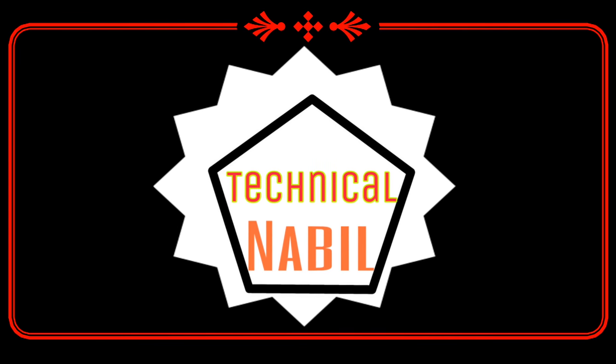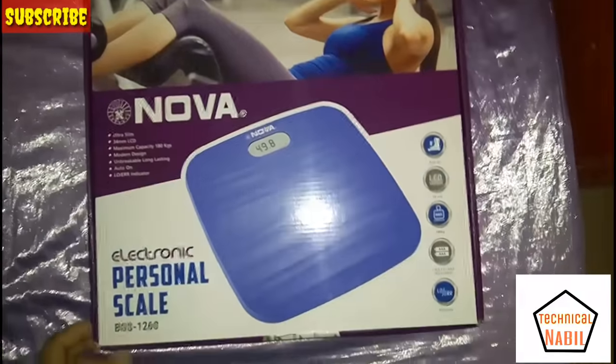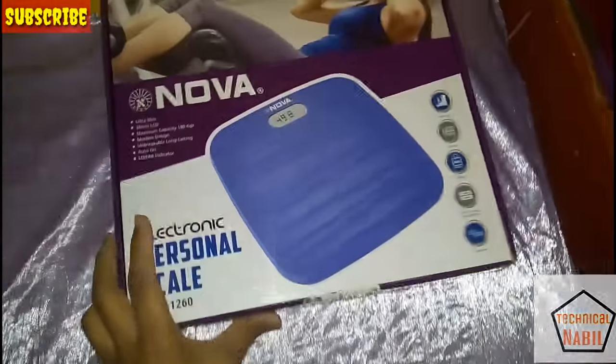Hello everyone, welcome to Technic Annabeel. Today I am going to unbox the NOVA personal electronic scale.